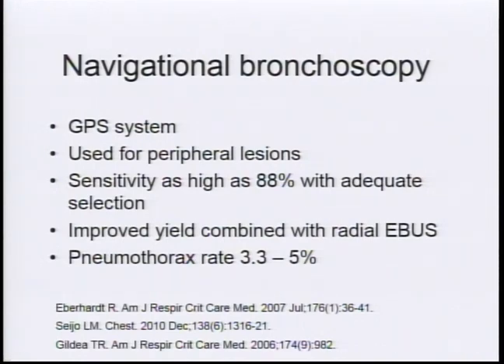So when you do a NAVI biopsy, the lung is a little beat up from the biopsies, and so it's a little heavier. And so you're more likely to need a chest tube from one of these pneumothoraces than from a pneumo from a CT-guided biopsy. Sometimes IR would just aspirate the air, and that's it. But it is a higher rate with percutaneous needle biopsies.